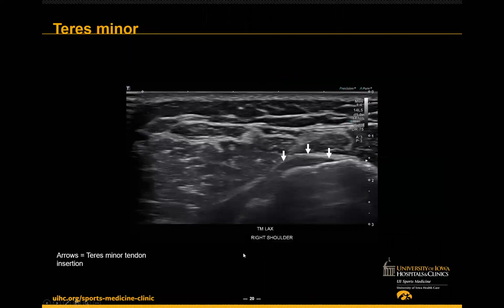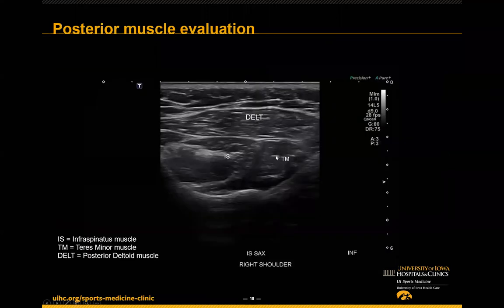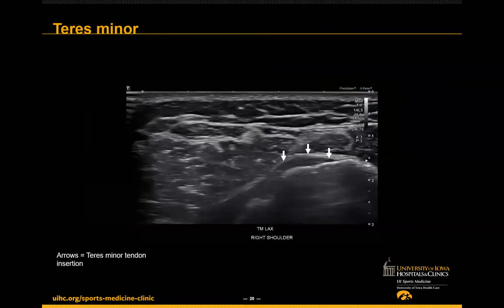After muscle evaluation, I get a view of the teres minor. It's pretty rare to have isolated teres minor issues, but I've had interesting cases of isolated calcific tendinopathy of the teres minor. This is a hard tendon to image — a lot of people end up getting the inferior infraspinatus instead of the actual teres minor. The way I find it: start in short axis, follow it laterally toward its insertion, then rotate the transducer to get a long axis view. The teres minor is a shorter, stouter, smaller tendon — quite different from the infraspinatus — and using that short axis trick and then rotating will help you identify it well.